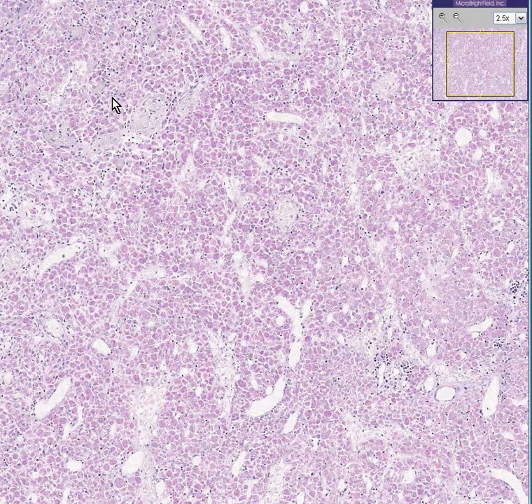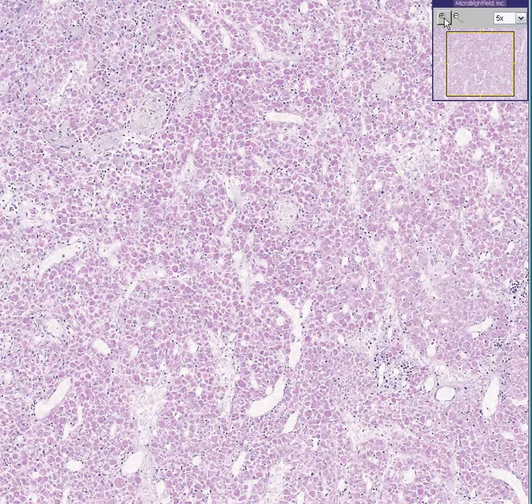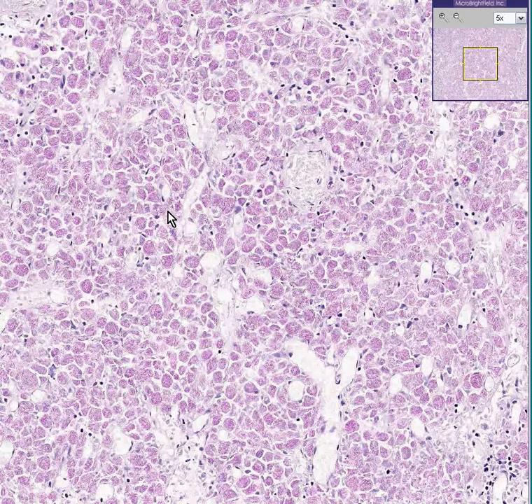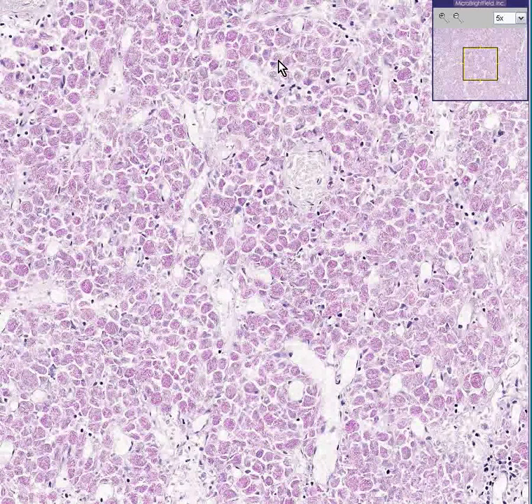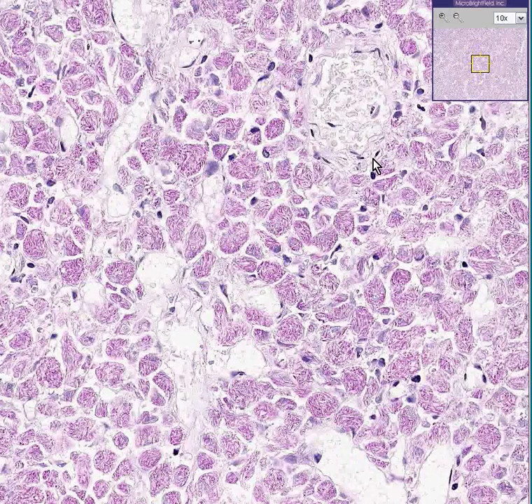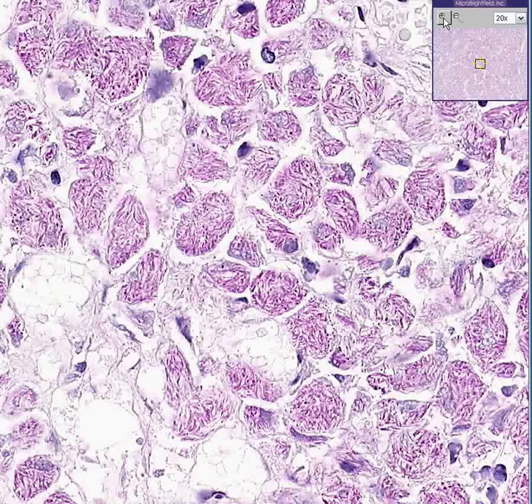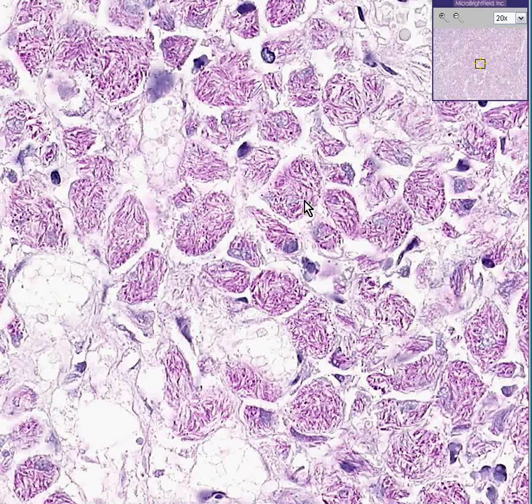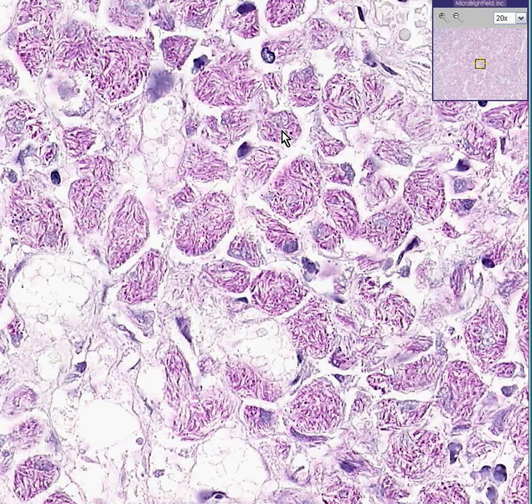What you can see are scattered little dotted nuclei — lymphocytes — as well as cells which you would see as foamy if you were doing the H&E stain. But with this particular stain, it's going to be staining things inside these foamy macrophages or foamy histiocytes, so that you can see very tiny little red rods that look very much like TB. That's because these are mycobacteria, like TB.